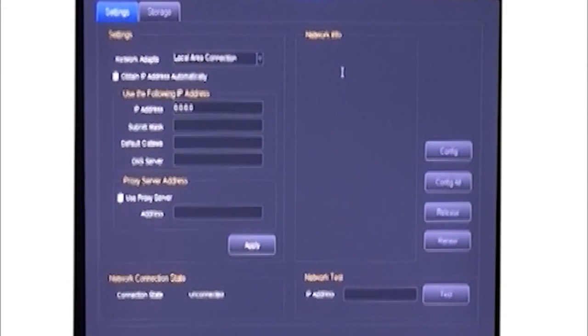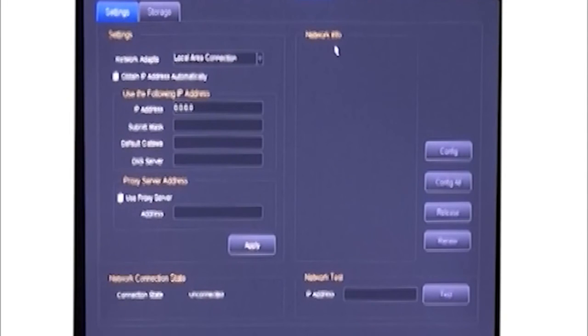Network is used to set up the network for the whole system, including network storage function.